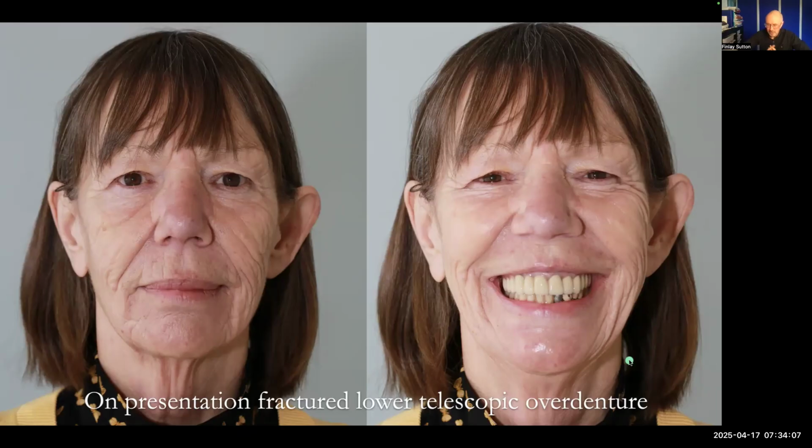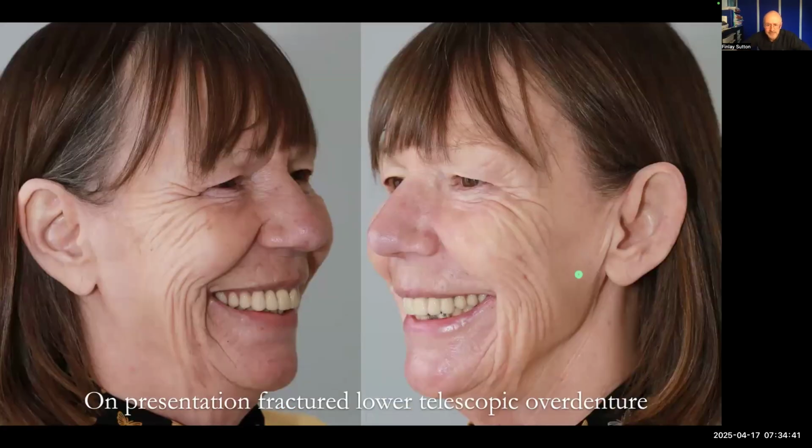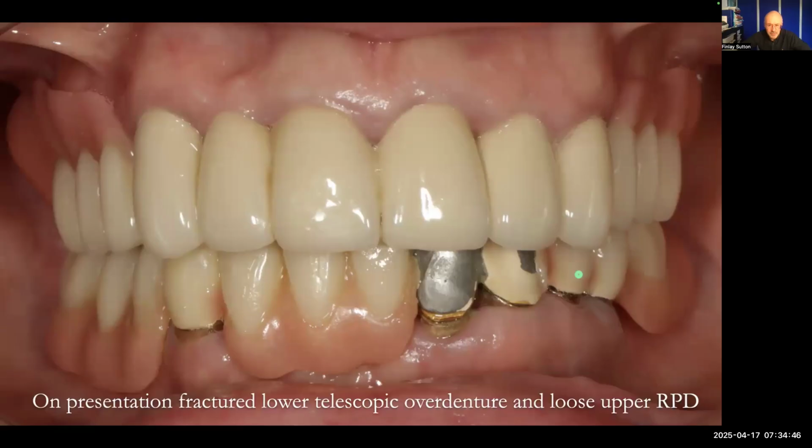And one thing that I really look at in particular when I've got a new patient in, particularly when I'm getting these photographs done, I want to see what they're going to look like. What's their full smile going to be like? How much gum are they going to show for those upper front teeth there? Interestingly, she does show quite a bit of that gum. And if she did have wire clasps, they would show on those upper teeth. She's got upper 3 to 3 there. So this is her on presentation when she came in for a consultation.